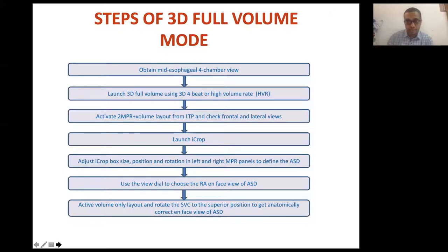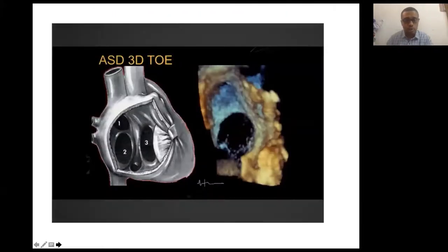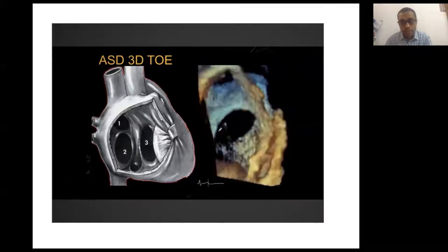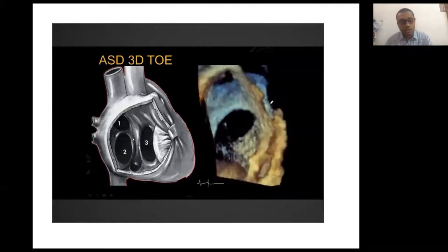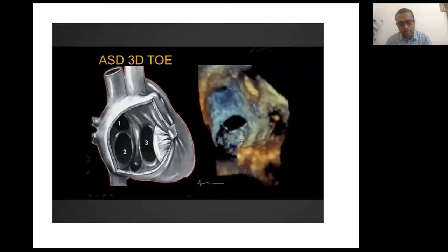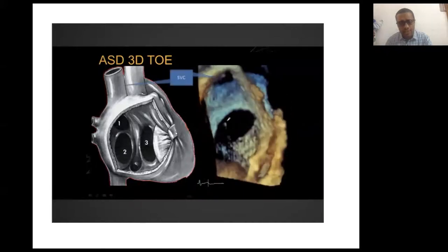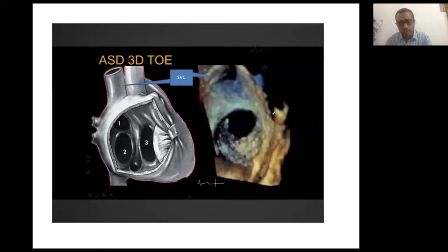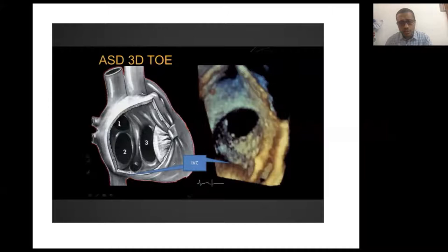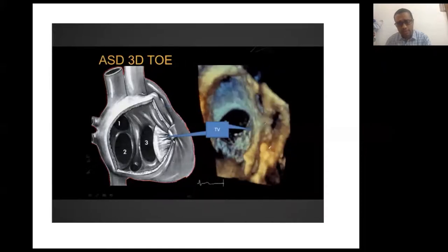This is a 3D en-face view of the right atrium. We can see the SVC, the atrioventricular region including the right coronary area, and the atrial secundum-type ASD with remarkable variation in its size. The SVC is visible at the top, the IVC and RCA groove are at the bottom, and there is a relatively central but oval defect with the AV valve tissue visible.